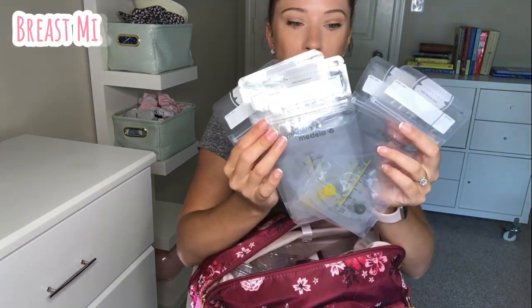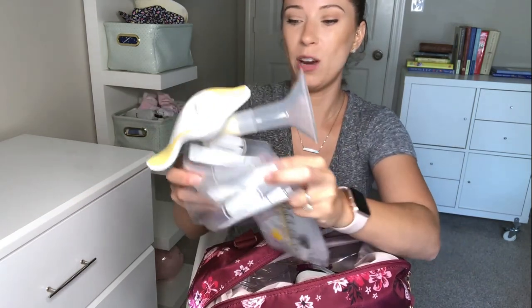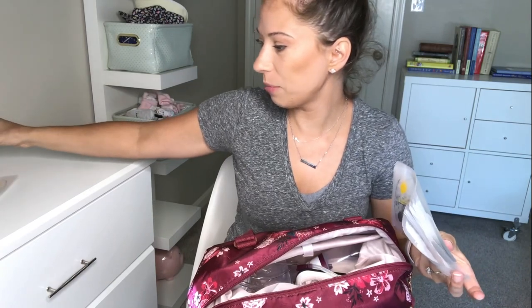Along with that, you want to have spare breast milk storage bags. I also have a hack for these: if you're at work and you forget your bottle to pump into, you can use a handy dandy hair tie, grab one of these bags or even any plastic baggie, and attach it with the hair tie around the top of the flange — and you're good to go. You can pump right into that.